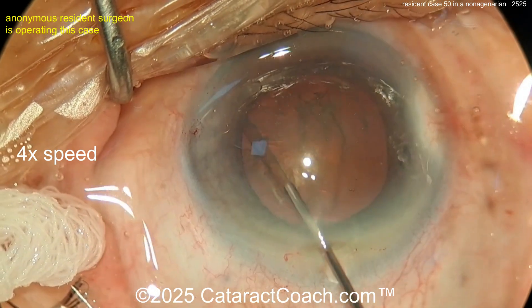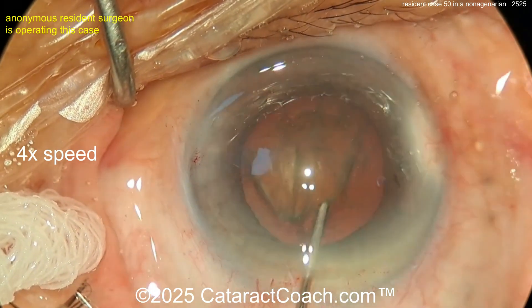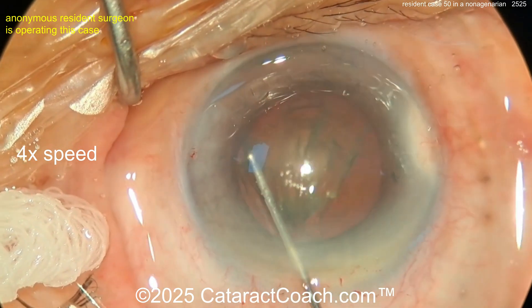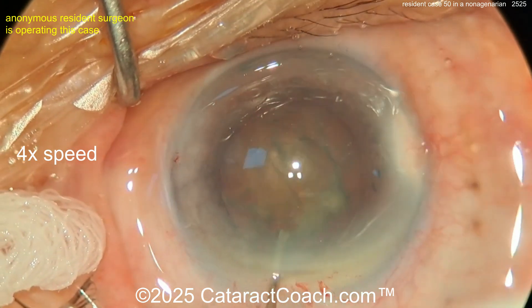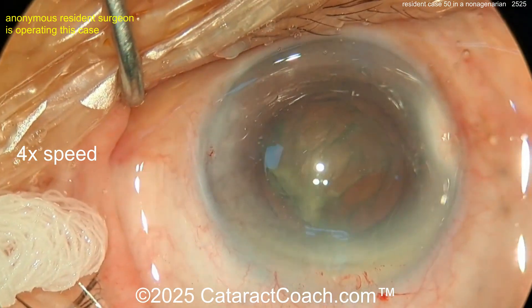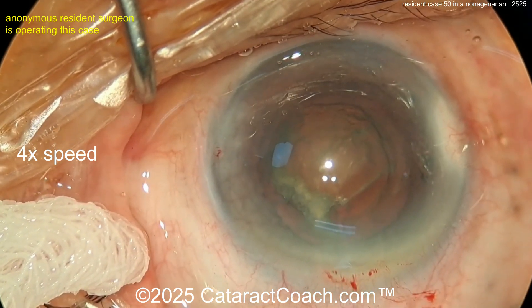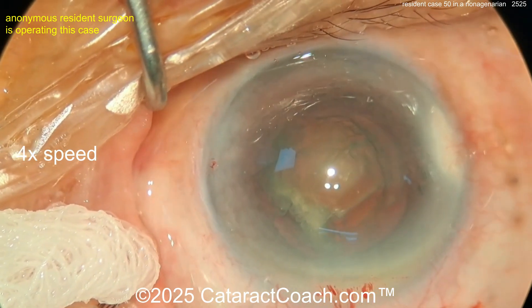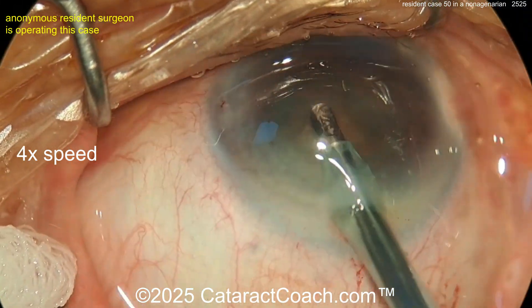Now for hydrodissection — nice and easy. Keep in mind with nonagenarians the capsular support is going to be a lot weaker, so you have to be careful. They also have a lower endothelial cell count to begin with — corneal endothelial cell count declines with age. There are no 90-year-olds with the endothelial cell count of a healthy 25-year-old. I liked the hydrodissection but I wish it spun more — as they say, if it does not spin, you will not win. Here comes the phaco probe.